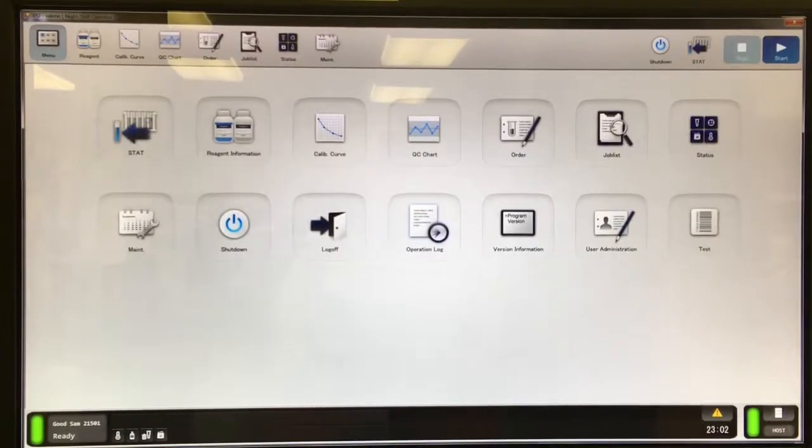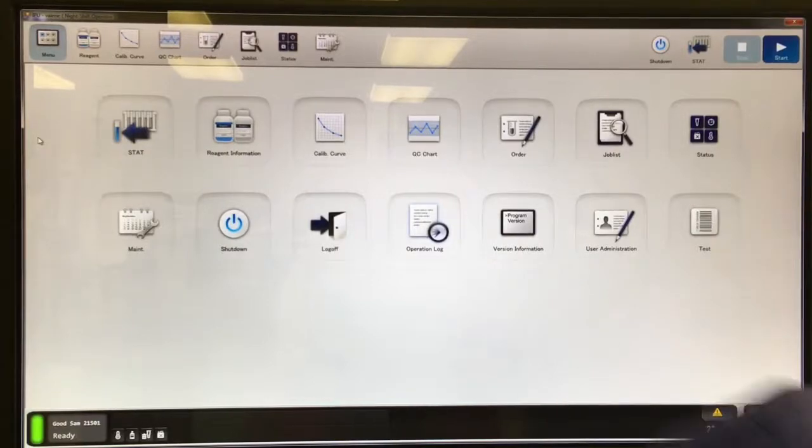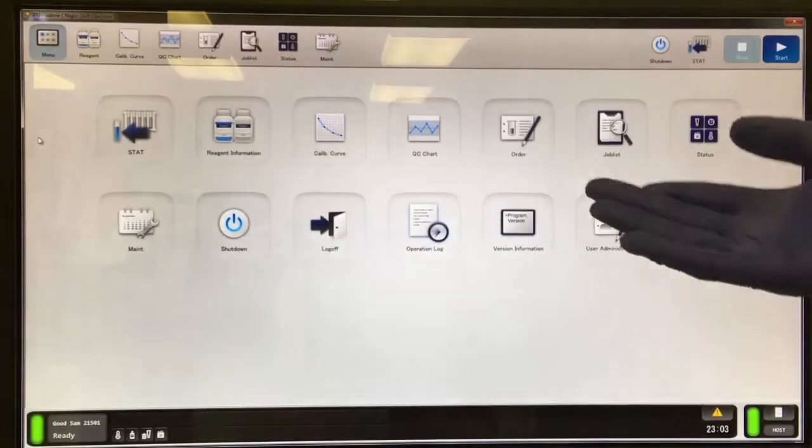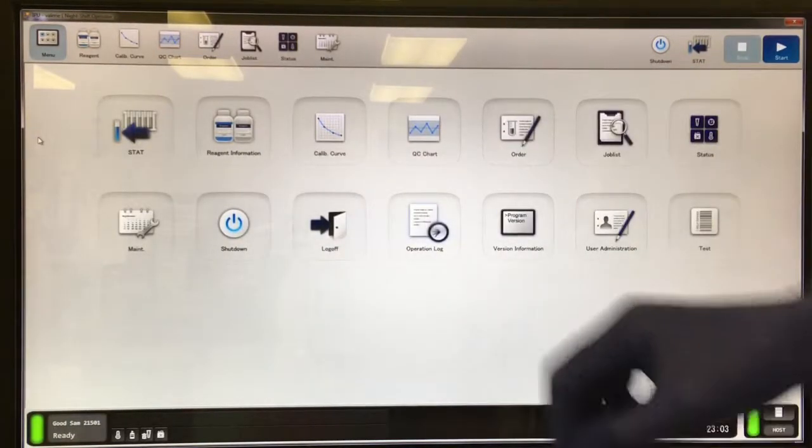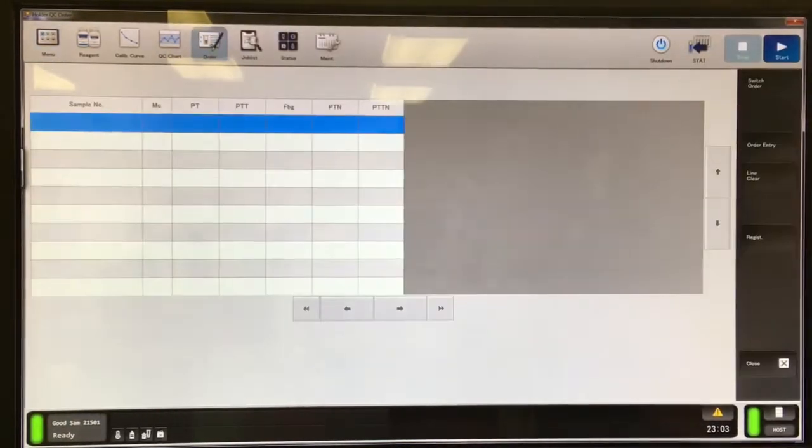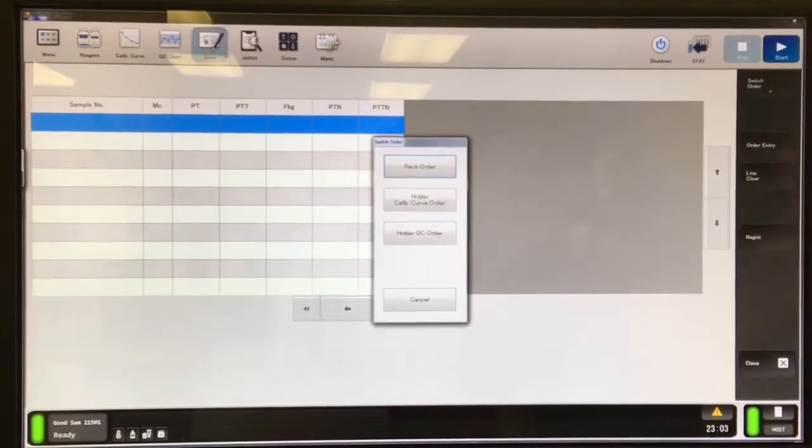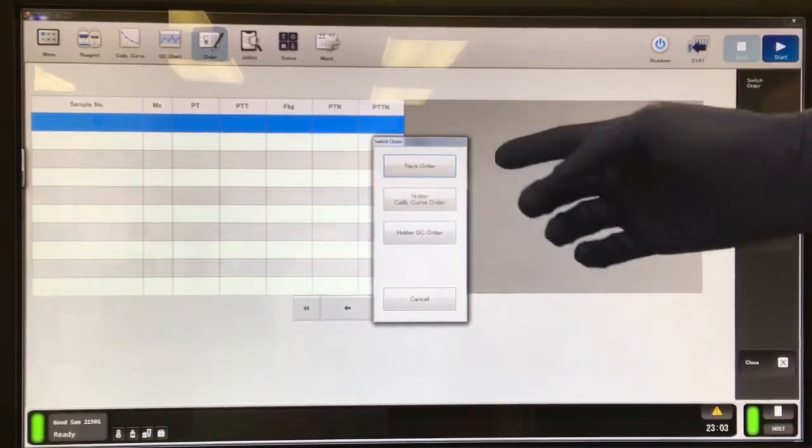In this video, I'm going to take you through the basic steps of ordering QC on the CS2500. Here you can see the main screen, but we're going to use the quick tabs. We're going to go to order and switch to order mode.